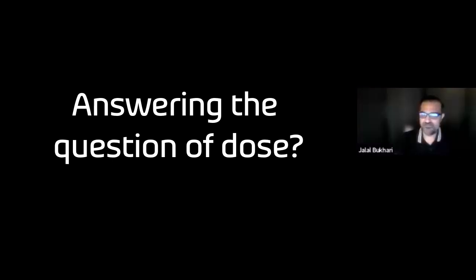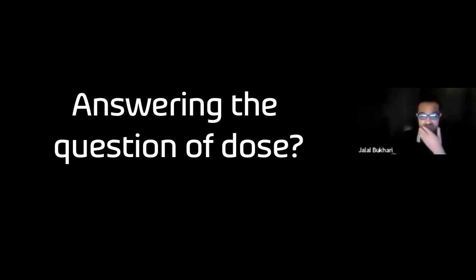Sure. So firstly, it's important to know what we mean by dose in radiology. So radiation dose is a measure of how much energy is absorbed when something or someone is exposed to X-rays. And this is important because it's the absorption of the amount of energy that can cause damage to a person. The harmful effects of radiation and the risks involved with its use must be considered when using any type of X-ray device.